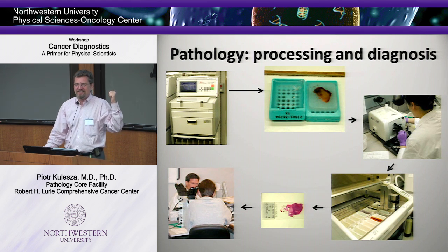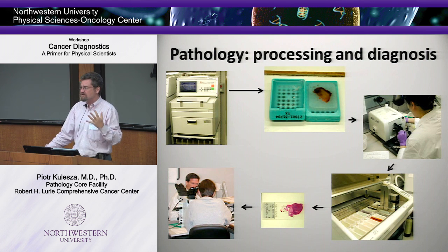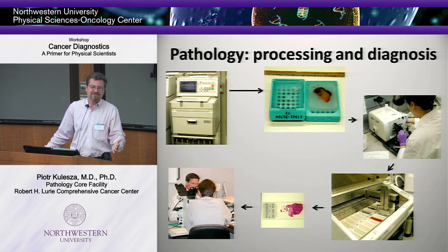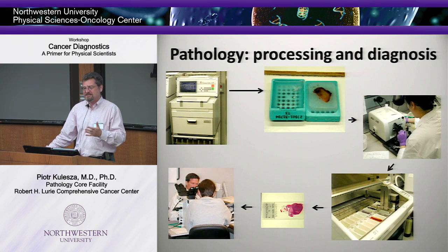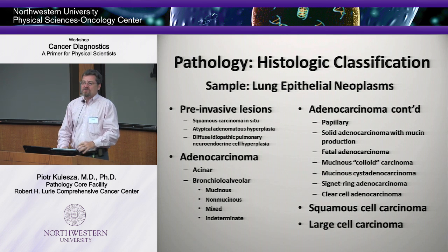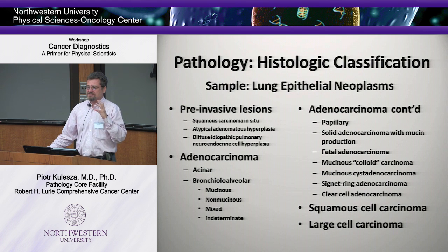But Mike Viglione is a pathologist, and what we do is we sign out cases. This is our lingo, this is our jargon. Our job is based on signing out cases. That's just for you. When you hear it, you will know what that is. Somebody sitting at a microscope, looking at the tissue section or cells, making a diagnosis. That's our process of sign out.